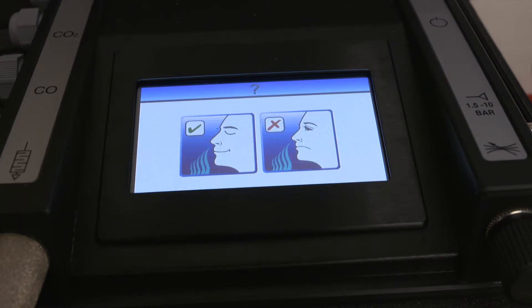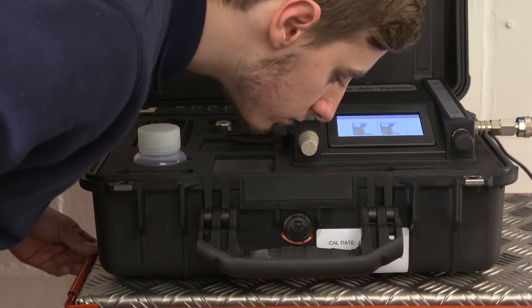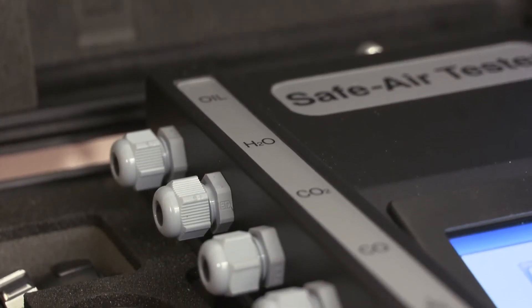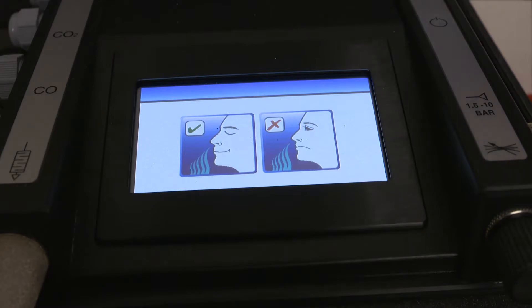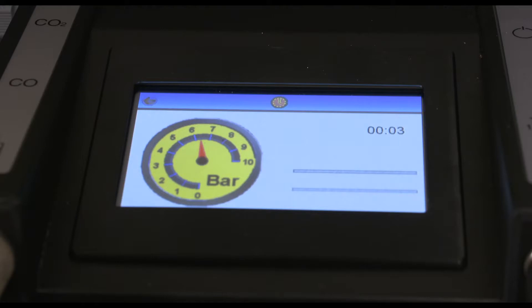Carry out the odour test by smelling the air exhausted from the sintered outlet. If there's a serious odour problem, fail the sample at this point of the test, as initiating flows of seriously contaminated air through the tube ports could result in damage to the unit. If the odour test is satisfactory, press the arrow key to continue. The unit will now commence a five-minute purge sequence, during which time an airflow will be passed through all four ports. This clears contaminants from previous tests and ensures that a representative sample is being tested.